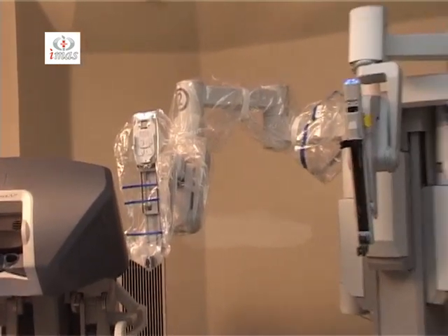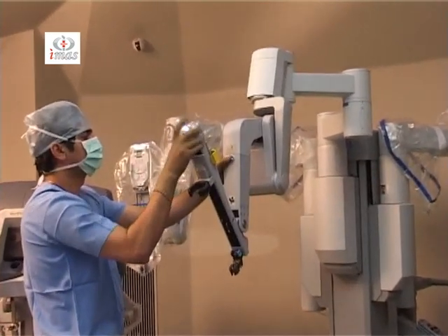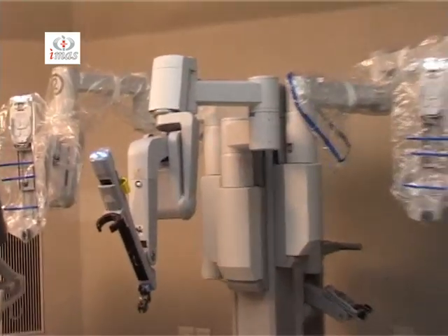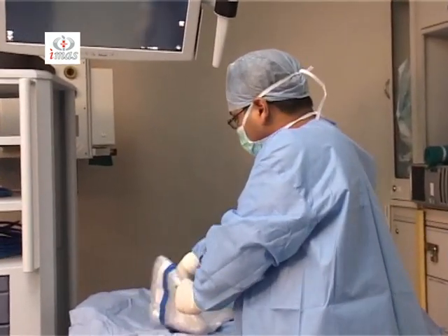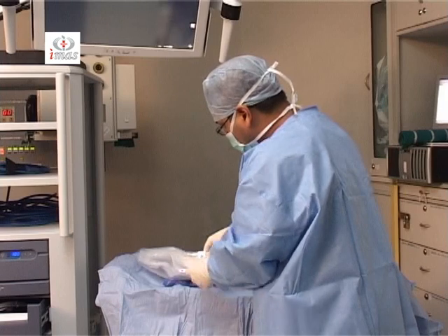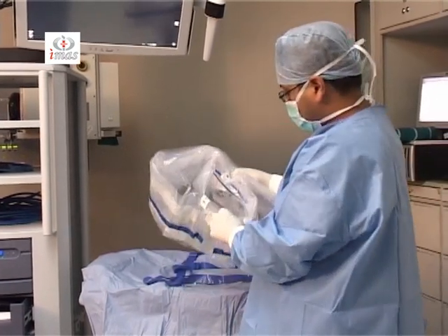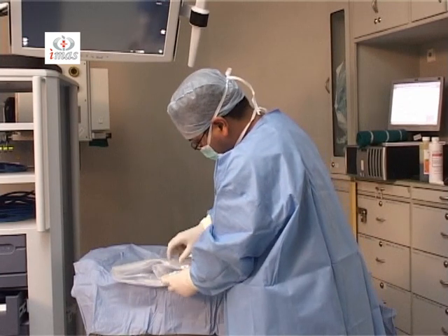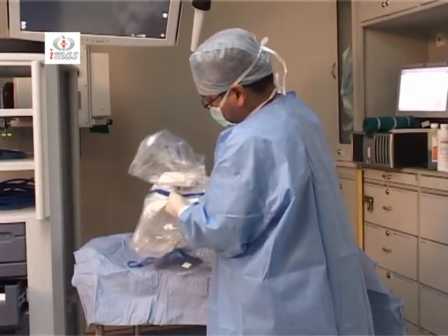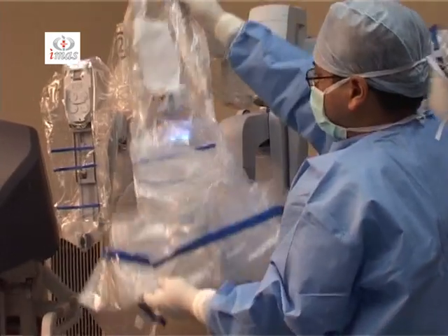Now to drape the camera arm, it again has to be opened up. The setup joints need to be opened up and the height is adjusted. We carry the camera arm drape, as you can see here on the sterile trolley, like this, and open up the small clips. We have to just hold it from here.